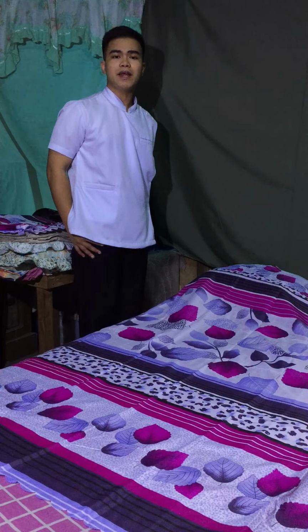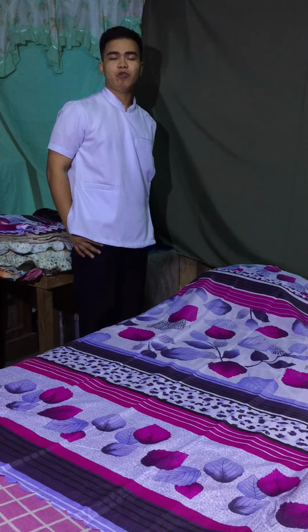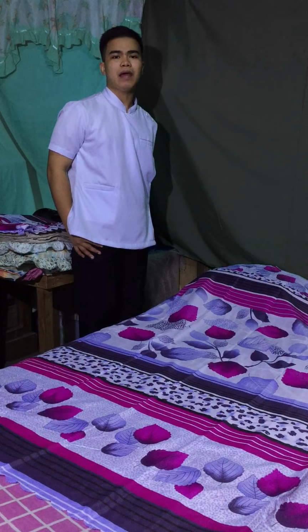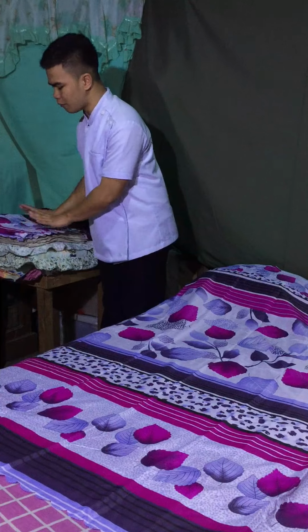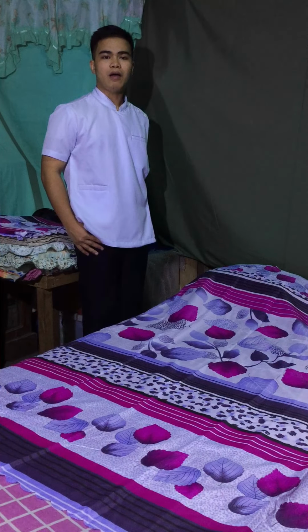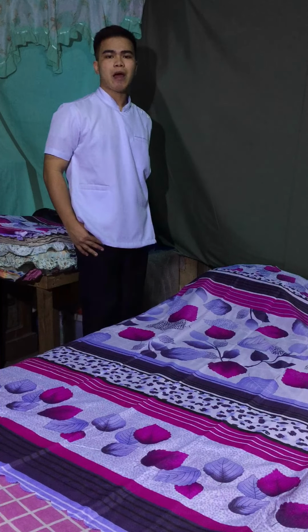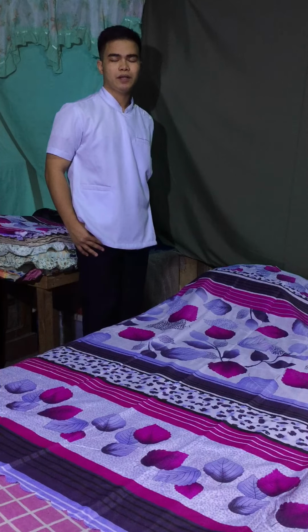Then, gather all the necessary equipment arranged on a chair by the bedside in the order in which items will be used. This is to save time and effort for an orderly procedure. So, I have already arranged it by the bedside table. Then, raise the bed to an appropriate working height, don on gloves if handling soiled linens. This is for proper body mechanics, prevents cross-contamination via soiled linen.